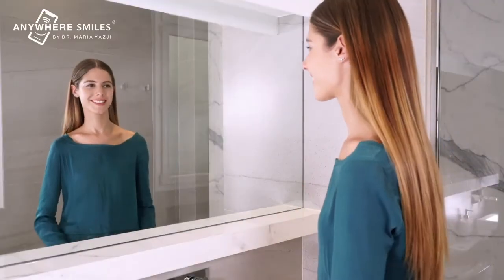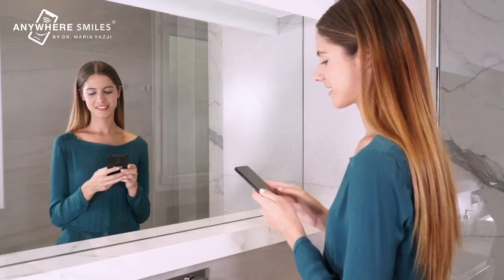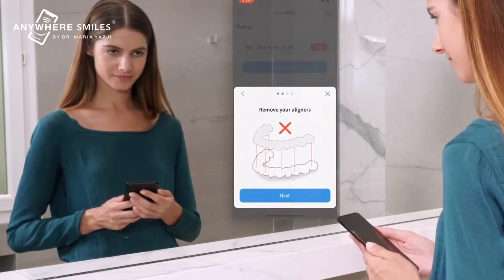Stand in front of a mirror. Open your dental monitoring application. The application is intuitive and will guide you. Press the Take Scan button and follow the instructions. Remove your aligners.